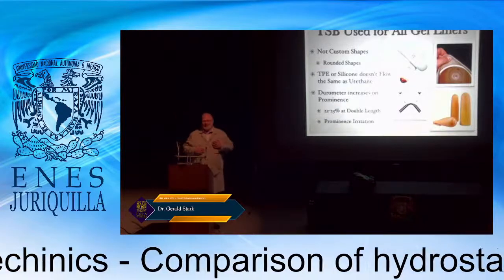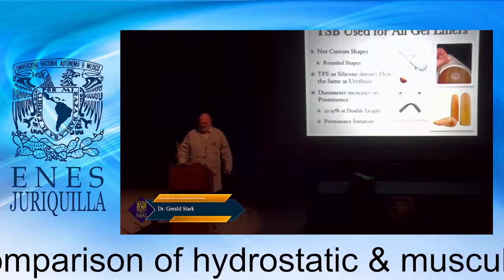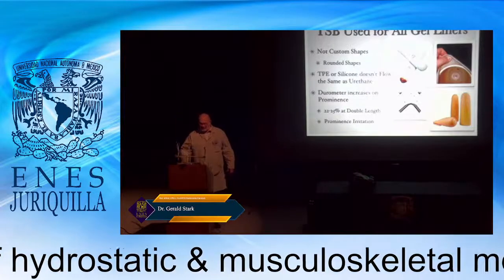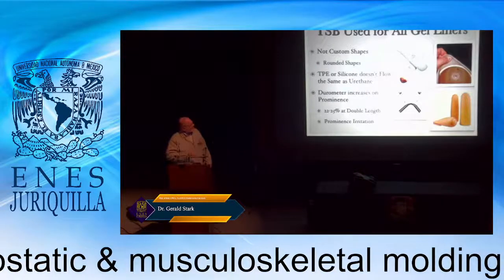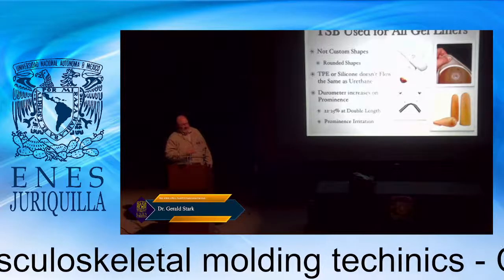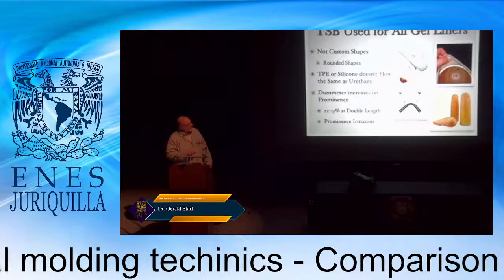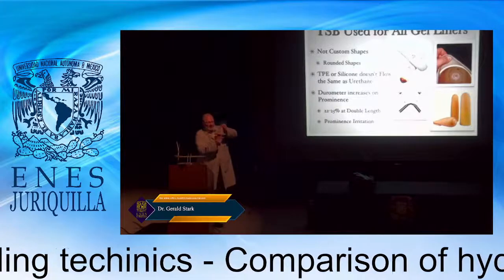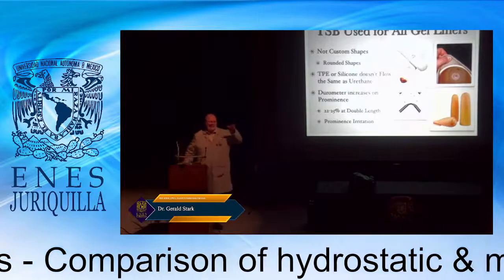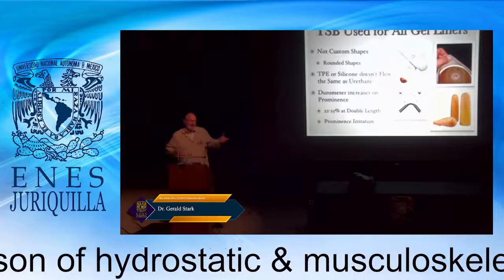One of the things I just want students to know, both today and in the present, is that you do have options in how you fit the patient, not necessarily the liner. Another issue with these is elongation. When you look at the distal attachment, that's urethane. That's not the TPE. That urethane has to be used for strength. And what happens is it begins to milk the end of the limb. And over time, you actually see reddening and sometimes edema of the distal end because it's really not fitting the patient in a custom way.